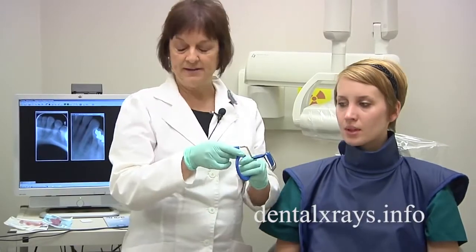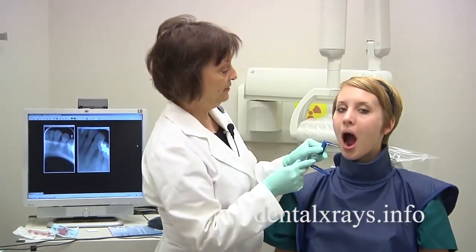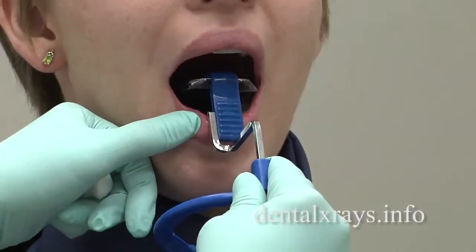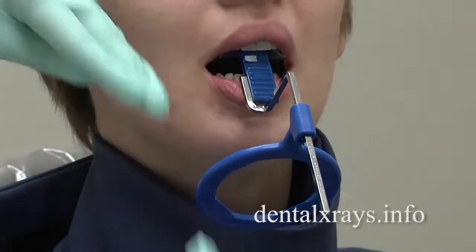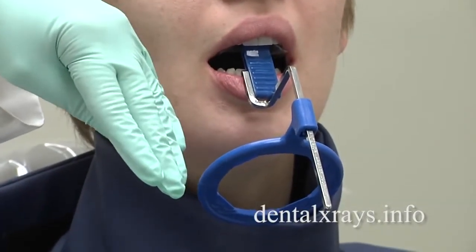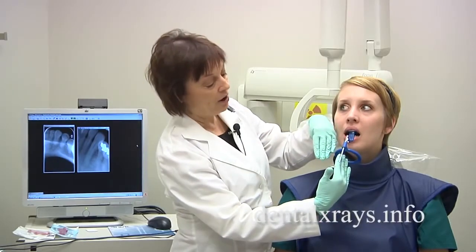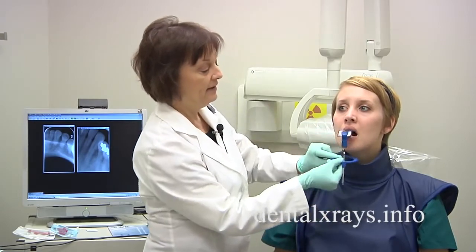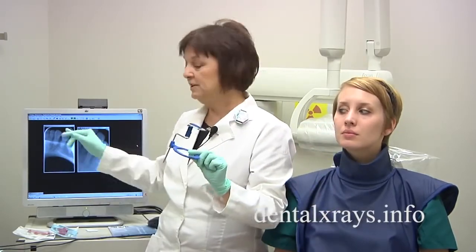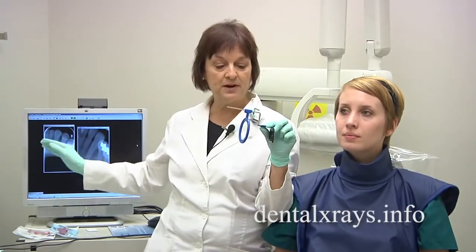I'll show you what happens to create that. When you put it in — if I did not roll it up — gently close, you can see now the whole unit is actually tipped downward. By having an upward direction of the x-ray cone, you're really coming from bottom up and it's actually projecting a very, very short image. So rolling it up before she bites will eliminate this problem.